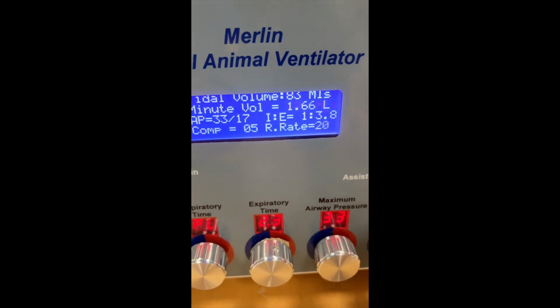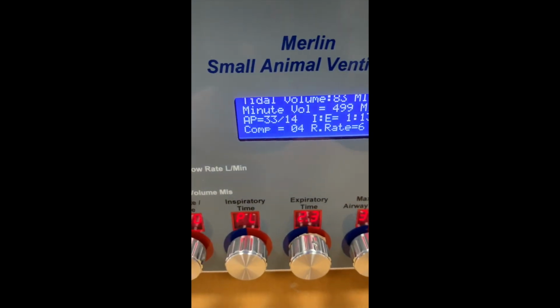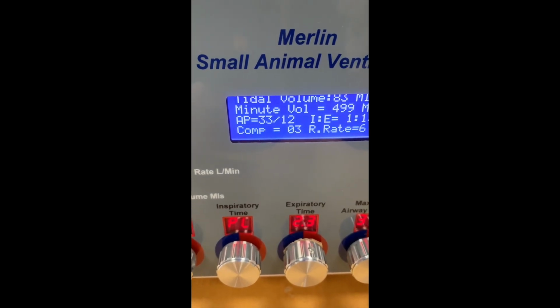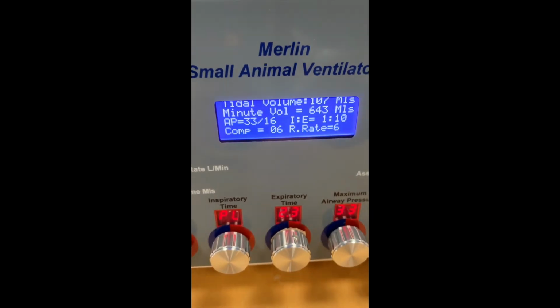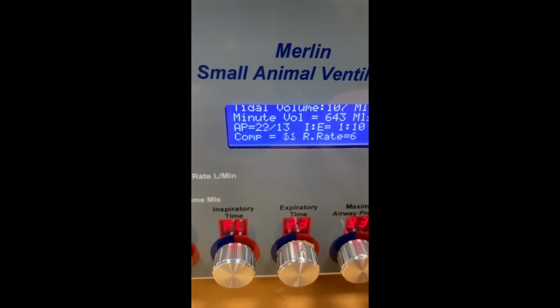And this of course can be used in conjunction with the assist mode, which I've just put on. So now we have our PEEP value there. And it behaves in exactly the same way whether we have the assist mode on or off.